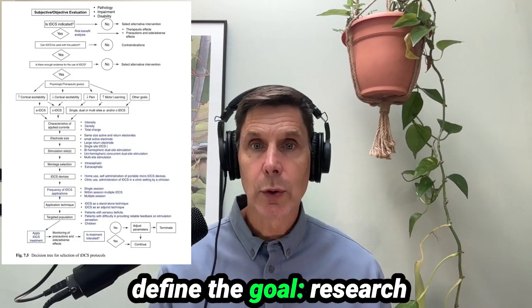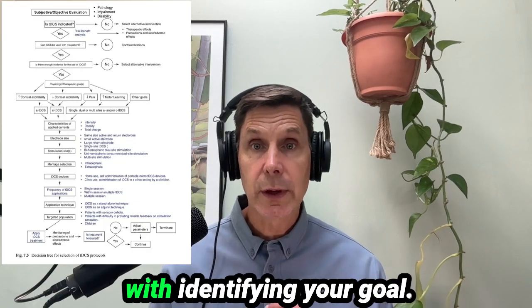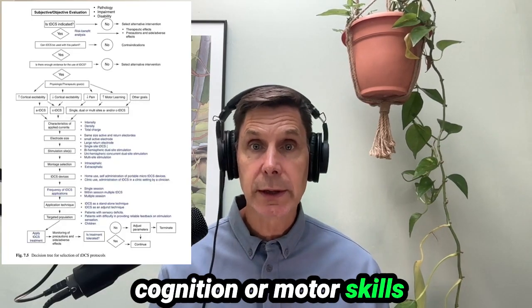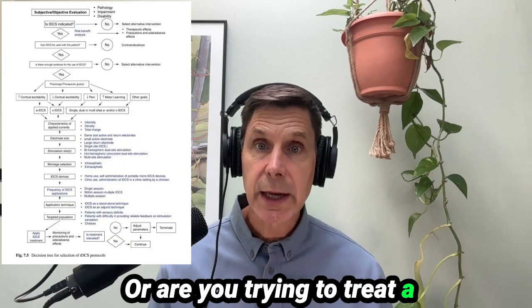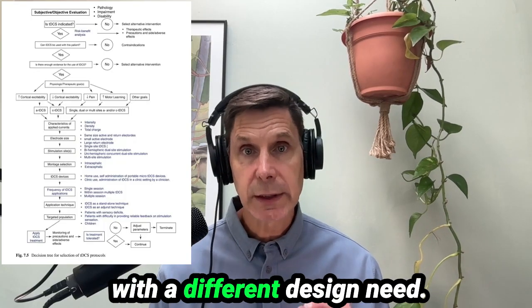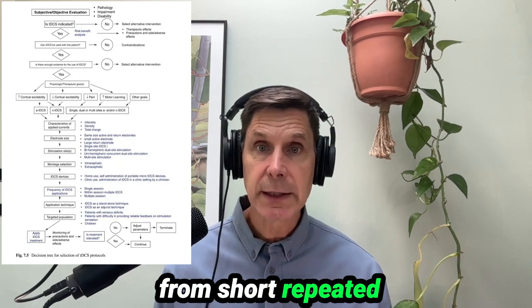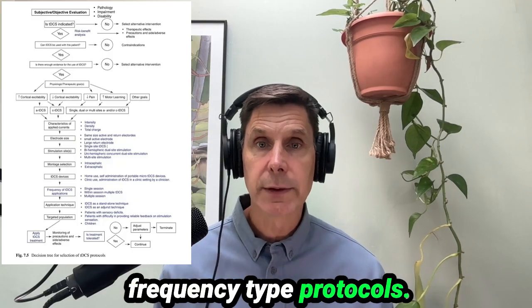So now we're going to define the goal: research, enhancement, or therapy. So the protocol should begin with identifying your goal. Are you trying to explore cortical function in a research setting? Are you trying to enhance cognition or motor skills in a neuroenhancement or neurorehabilitation setting? Or are you trying to treat a condition like depression or, again, stroke recovery in a therapeutic sense? Each of these goals comes with a different design need. For example, cognitive enhancement might benefit from short repeated sessions, where rehabilitation might require longer, high-frequency type protocols.